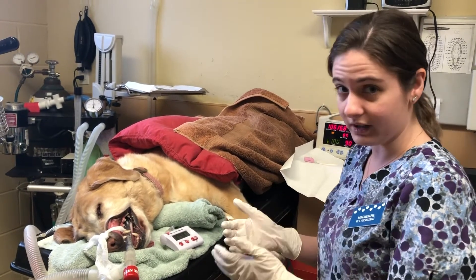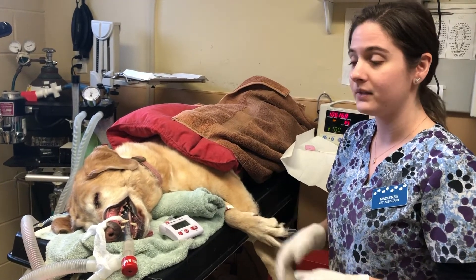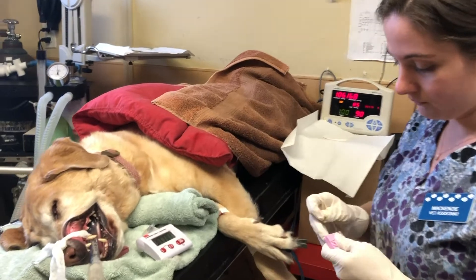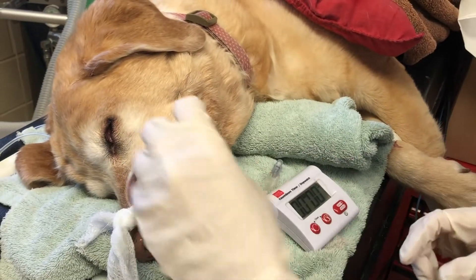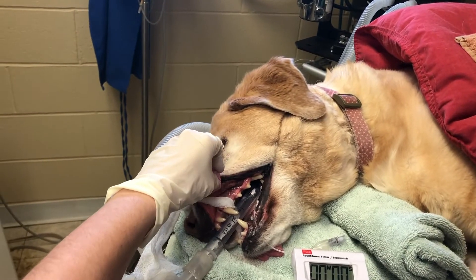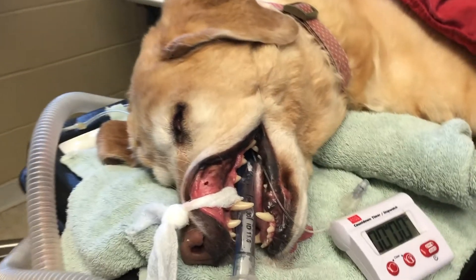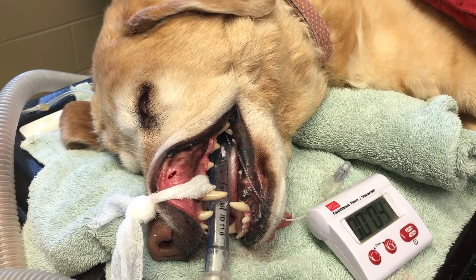Since our patient has been anesthetized and is in lateral recumbency, and since I've already done the first step with the gauze strip, I'm going to take my lancet and place it onto the mucosal surface and make an incision. As you can see, the blood is there. I'm going to start my timer so that we can start to record the bleeding time.